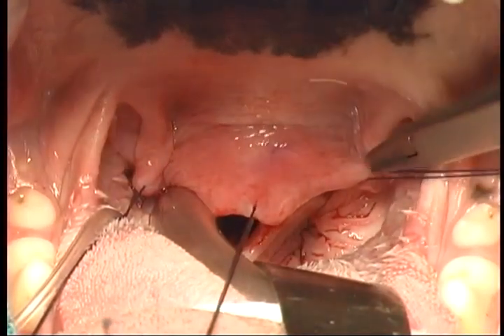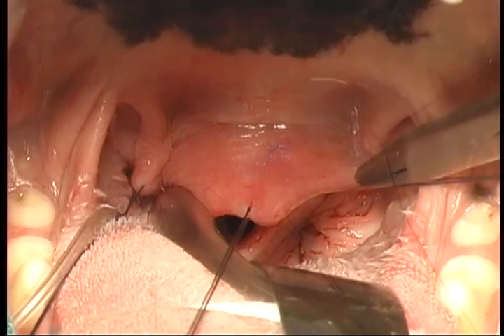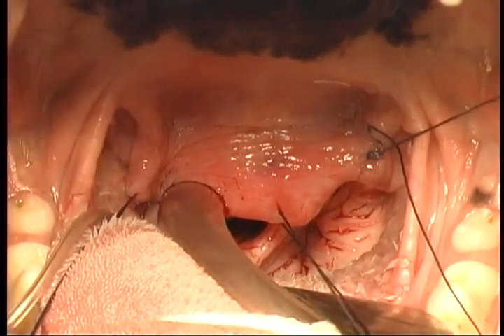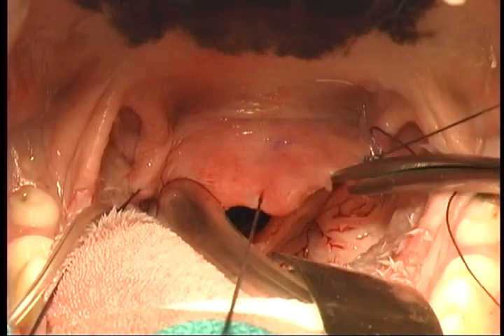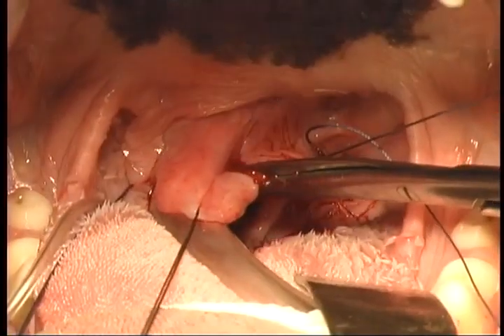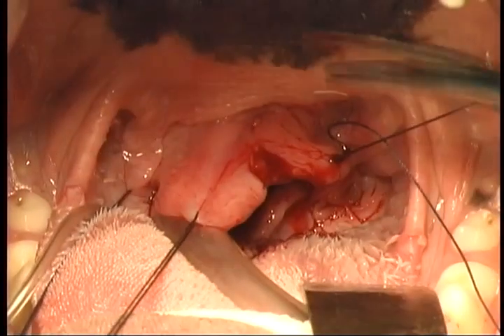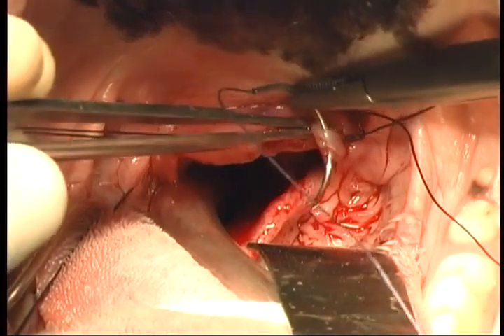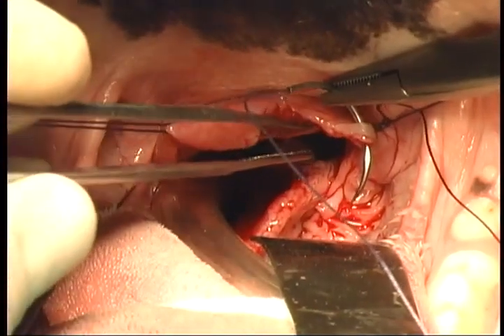Braided absorbables such as polysorb or dexon are the most supple and therefore the most comfortable. In this particular case, we have chosen dexon to close this palate resection that we're performing in this bulldog.